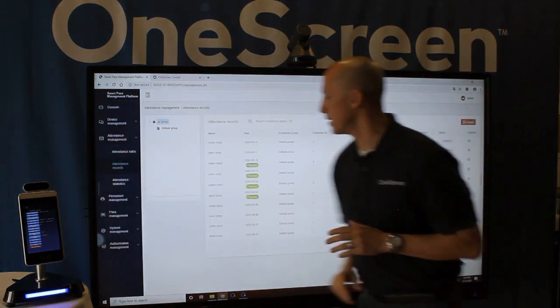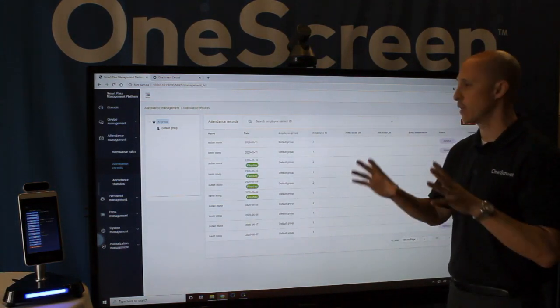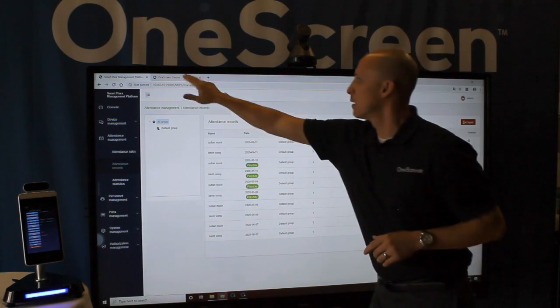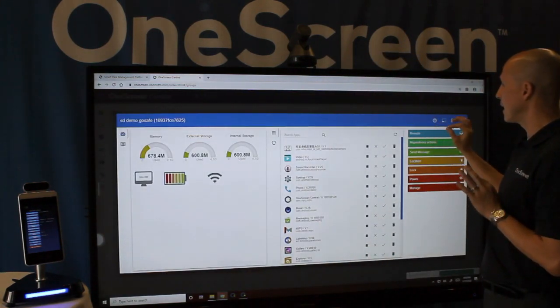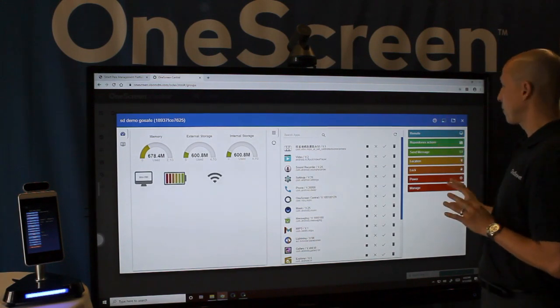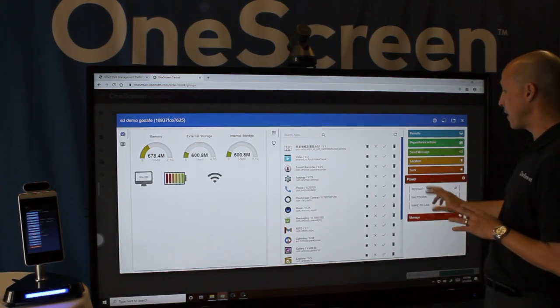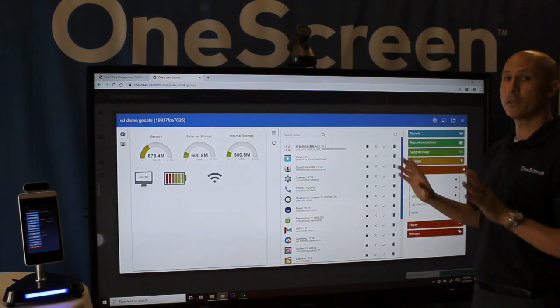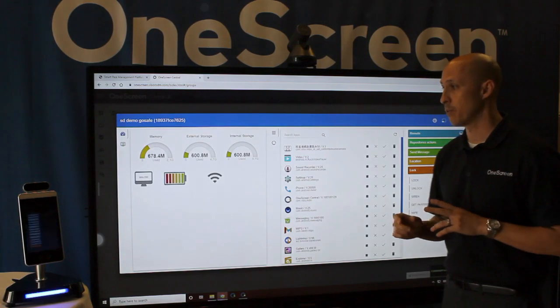Going into attendance management, this is where you have the ability to manage all of your attendance records and applications. Additionally, you have the ability to access any of the devices remotely through our platform. You can send messages, turn devices on and off remotely, and all the devices can sound a siren in case of emergencies — and we're going to go ahead and give you an example of that right now.